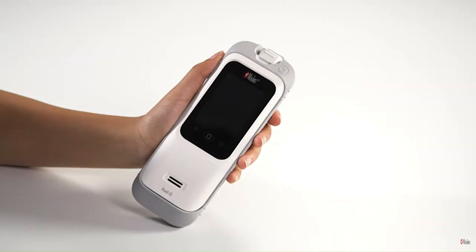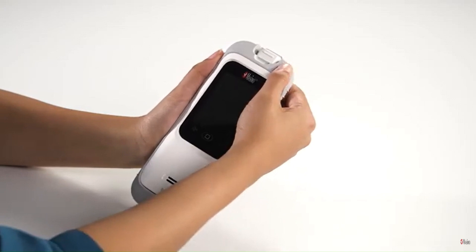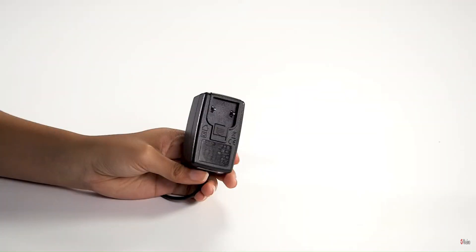Power on the RadG device by pressing the on/off button. Ensure that the RadG is fully charged. To charge the RadG, use the power cord and plug assembly insert included in the box.